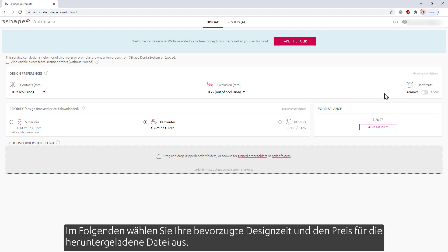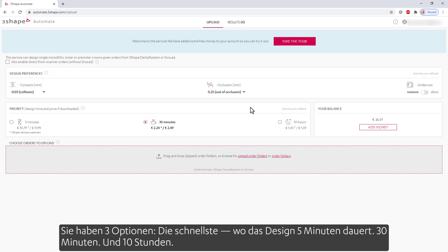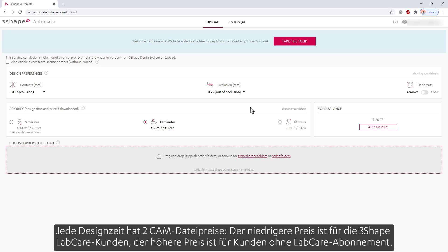Below, you will choose your preferred design time and the price for the downloaded file. You have three options: the fastest, where the design takes 5 minutes; 30 minutes; and 10 hours. Each design time has two CAM file prices. The lower one is for the 3Shape LabCare customers, and the higher is for customers without a LabCare subscription.